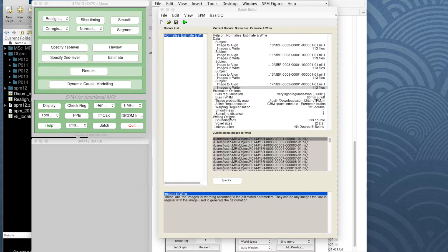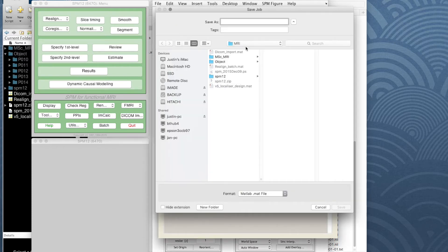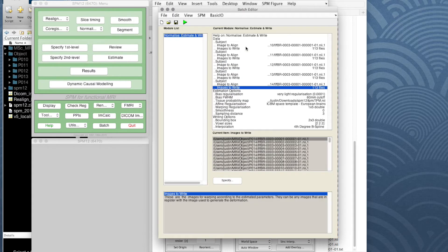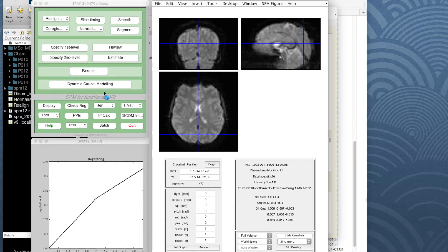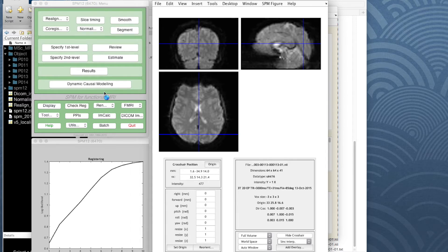Do note that when it writes a new set of images the voxel size is going to change — by default it writes to a two-millimeter cubic voxel, whereas our input images are three-millimeter. So images are going to appear more detailed than they actually are; they'll be interpolated to higher resolution. You can save that batch if you wish — we'll put some of those together later — then just set it going to run. As it runs it gives us some information about what it's doing; normalization is actually quite a complicated procedure.